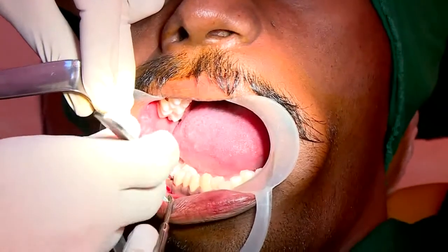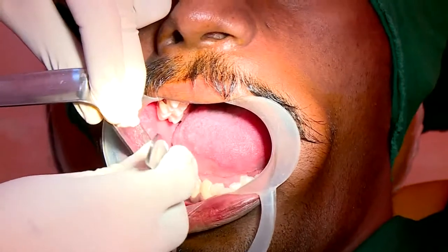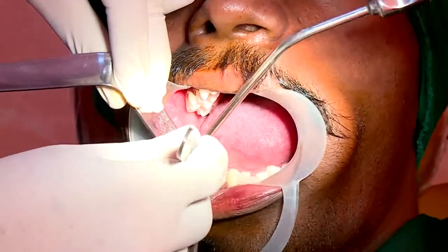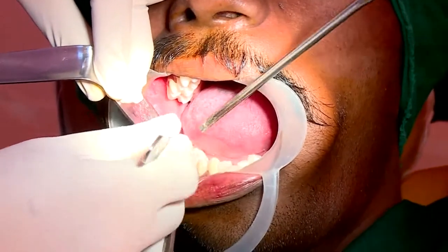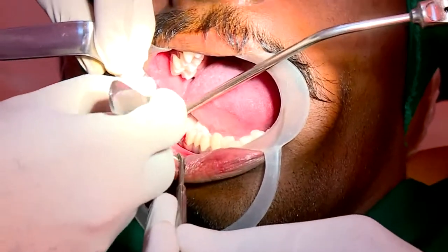Because as a beginner, you should not slip, you should not damage any tissue. It will start all of us with a little handshake in the beginning. But always remember, show confidence in front of the patient. Do it slowly with a proper technique and proper grasp. Usually it takes about a minute.